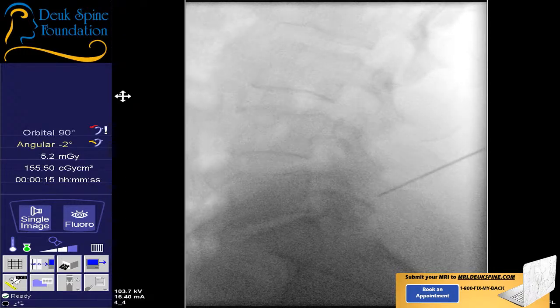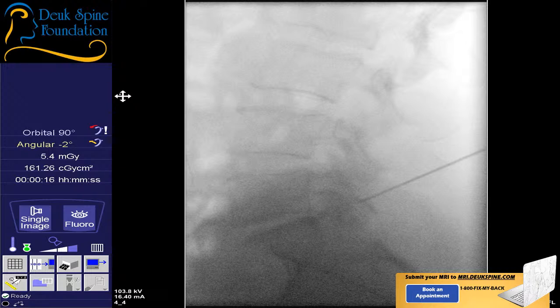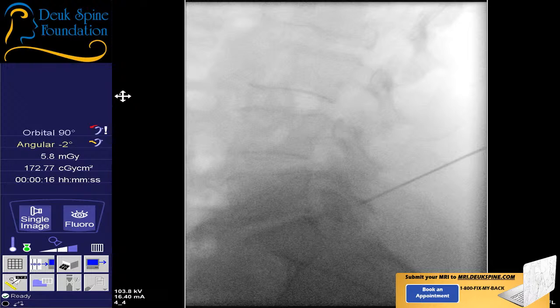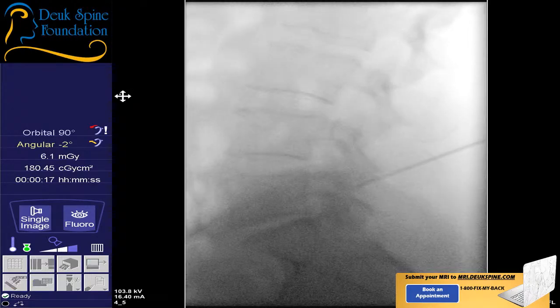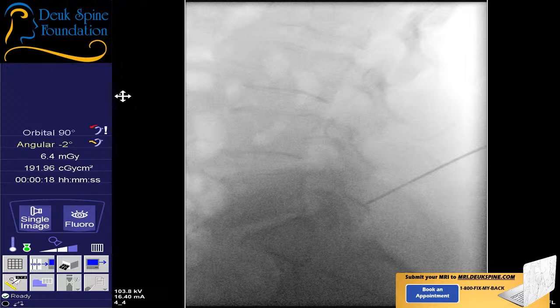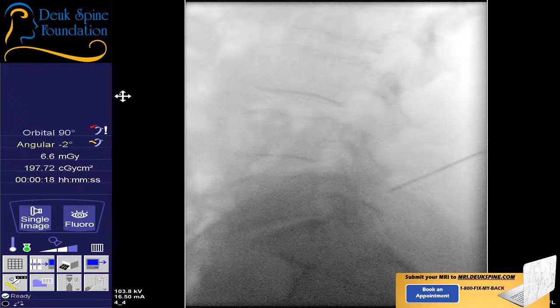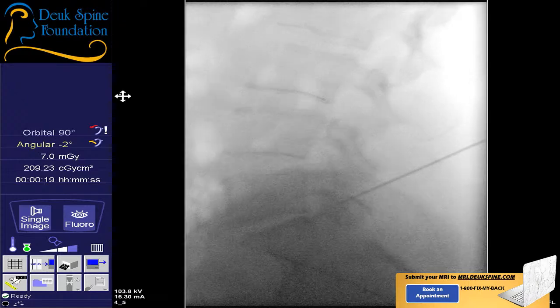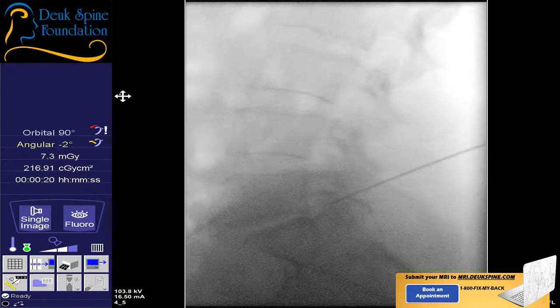Shot. Shot. Shot. So I'm trying to get around the facet joint pretty close. And everyone's anatomy is a little different. Shot. Shot. Shot. Shot. You're doing great. Shot. Shot. Shot. Shot.